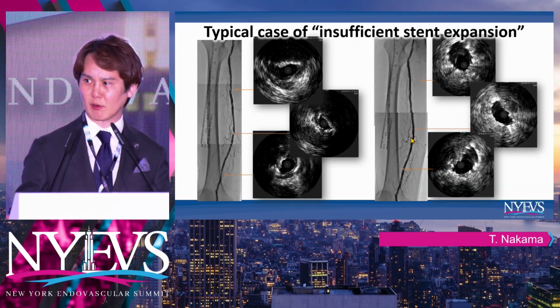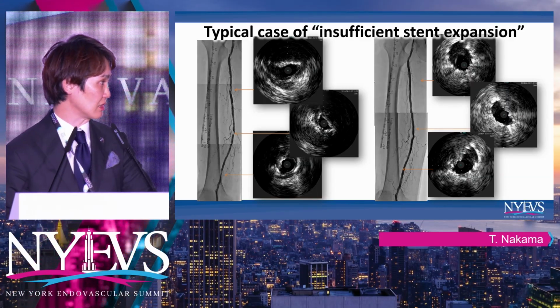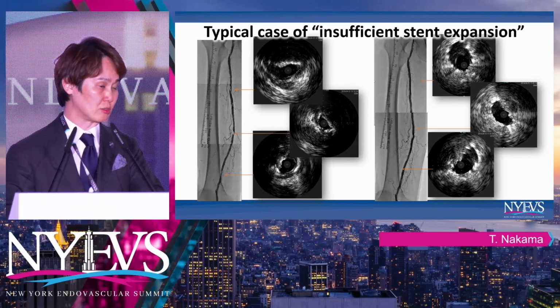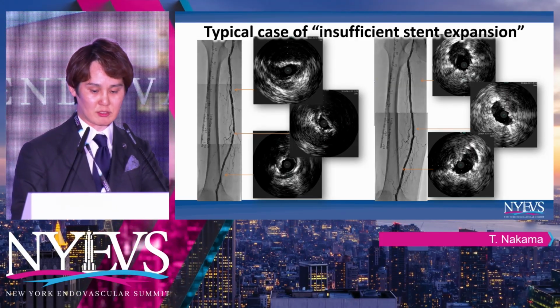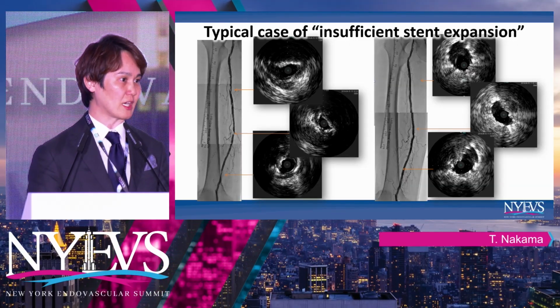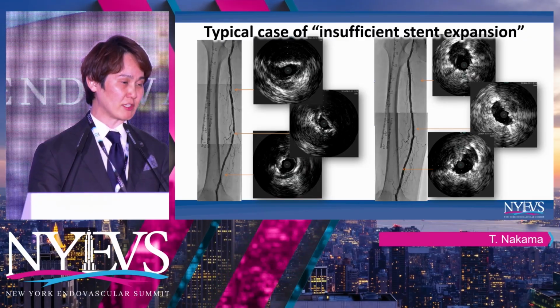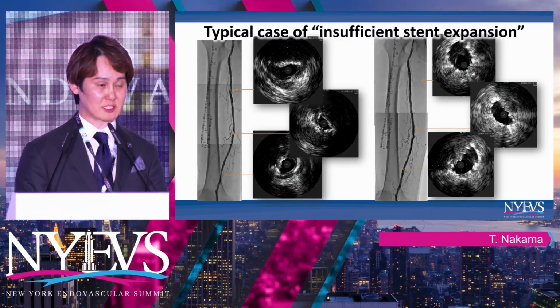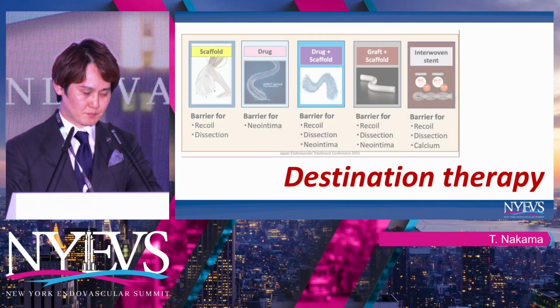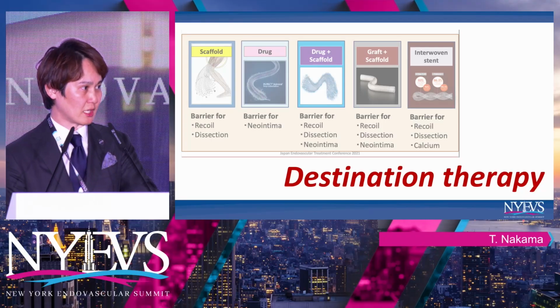I think it's quite simple. All of you can easily imagine that an insufficiently expanded stent is highly related to a higher restenosis rate. Yes, before the stenting and also after the stenting, we have to expand it aggressively in these kinds of situations. Anyway, first I'd like to talk about how to finalize our treatment.